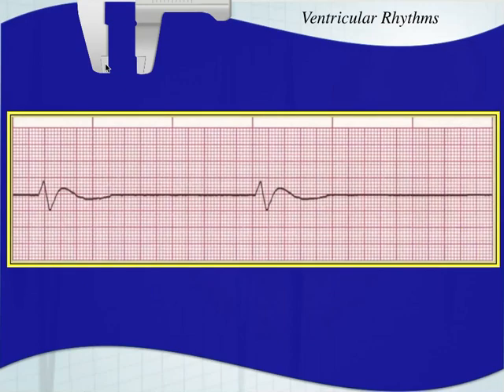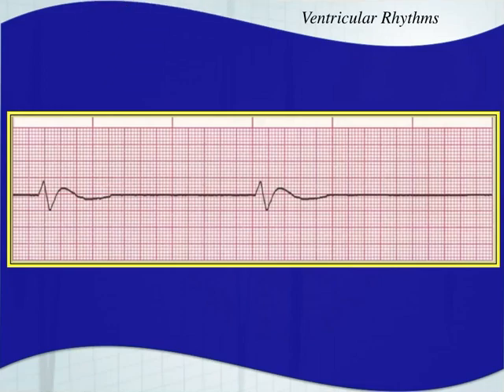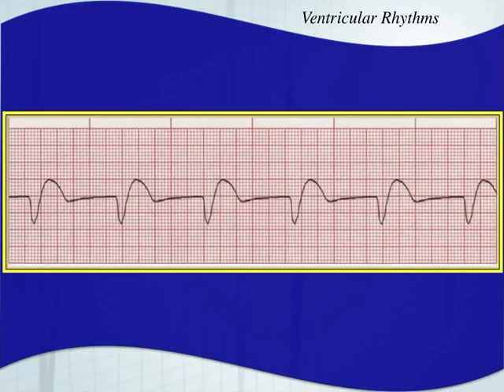Looking at the next one, this looks very slow — we have two beats on a six-second strip, so this is about 20 beats per minute. It's a wide QRS complex. We really can't identify regularity because we only have two beats to work with. But we can say: wide QRS complex, no P waves, 20 beats per minute. That fits the rules for idioventricular rhythm. You'd want to print a longer strip to confirm.